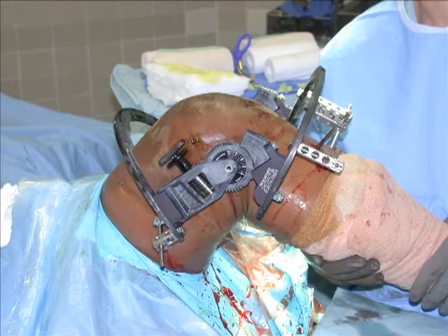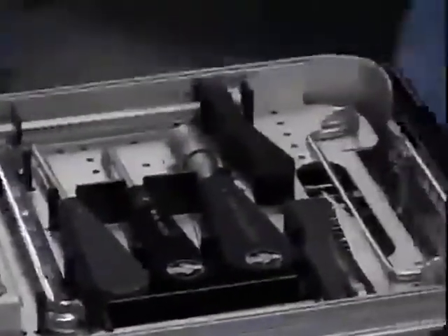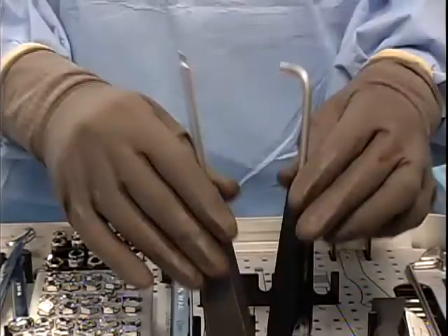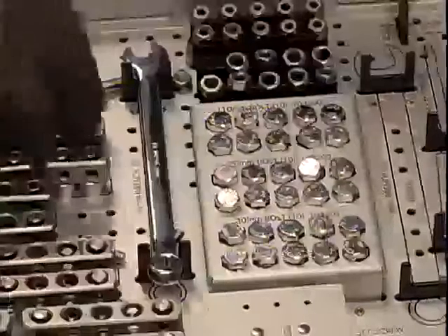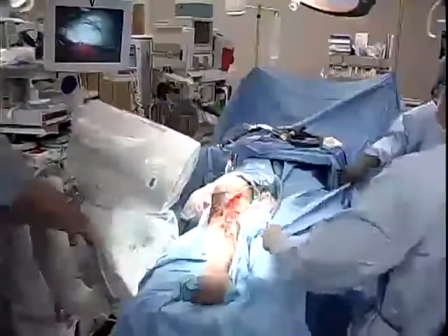Before demonstrating application of the hinge, let's look at the system components. The equipment is similar to the Ilizarov external fixation system. The workhorse is the triple trocar for placing Schantz pins. The quick chuck allows easy pin implantation. Both straight and right-angle screwdrivers are included, as are 10 and 13 millimeter wrenches. 10, 20, and 30 millimeter bolts attach the various sized Rancho cubes. One through five-hole Rancho cubes, centering sleeves, and set screws complete the set.